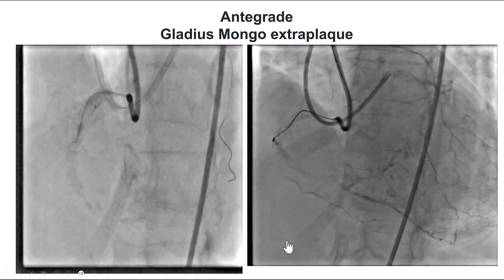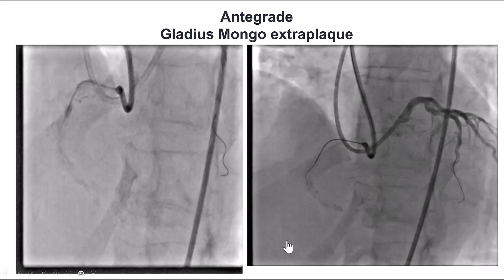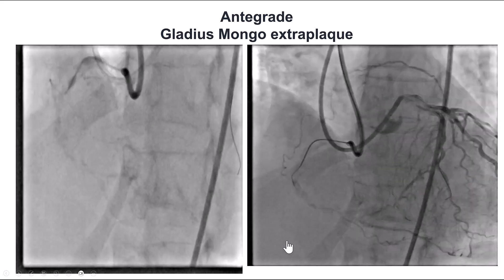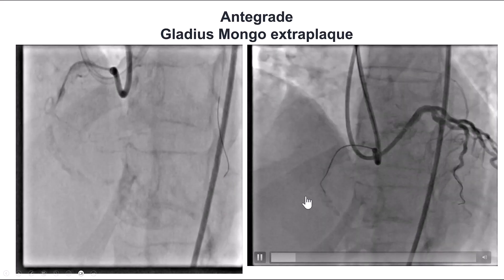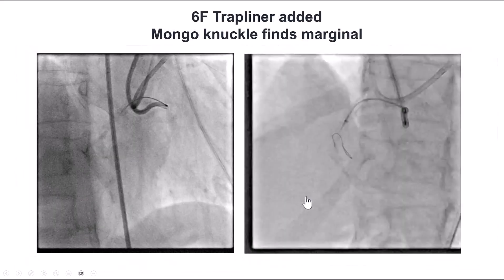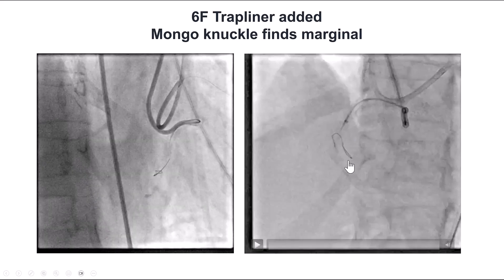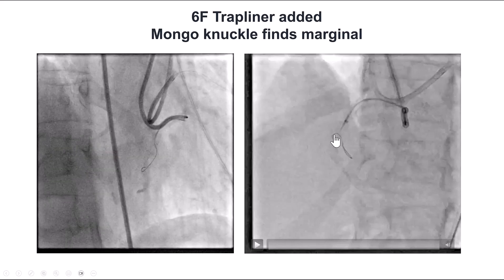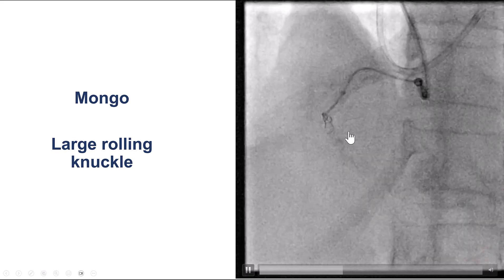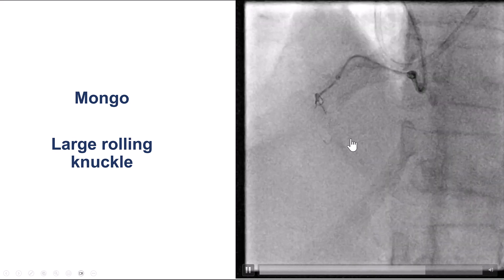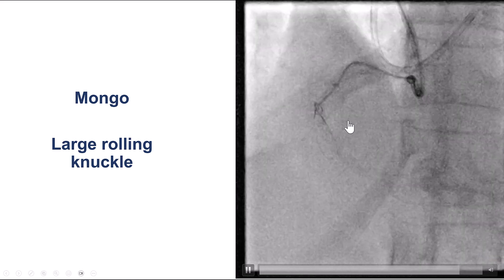After multiple attempts, we decided to go back to the antegrade approach and this time tried to do antegrade dissection reentry. We advanced the Gladius-Mongo guide wire, which seemed to go into the extraplaque space. The Mongo deviated a little bit into an acute marginal — it is very important to do orthogonal projections to confirm that the wire is not going across the course of the vessel. With repeated attempts, we were able to create a very large rolling knuckle with the Mongo that helped us bypass the acute marginal branch.